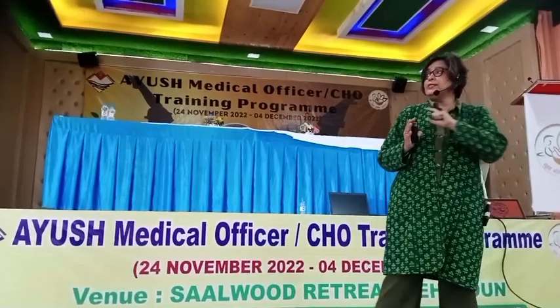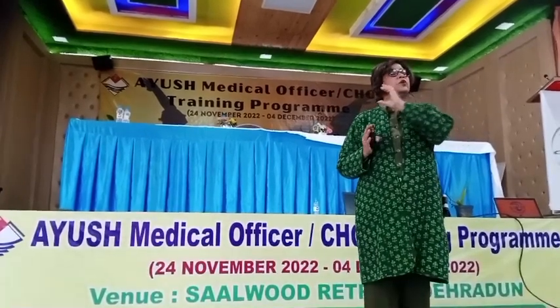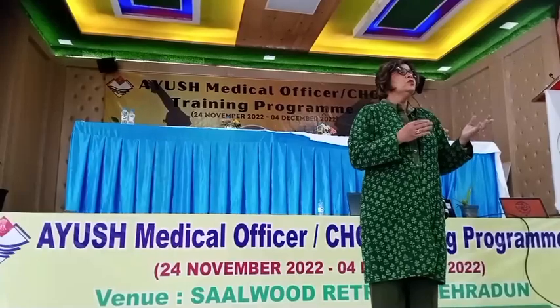Now, the problem with this sample is that the blood cells can be maintained only for 24 hours. If you test the sample after that, then your hemoglobin and platelets will have a problem.